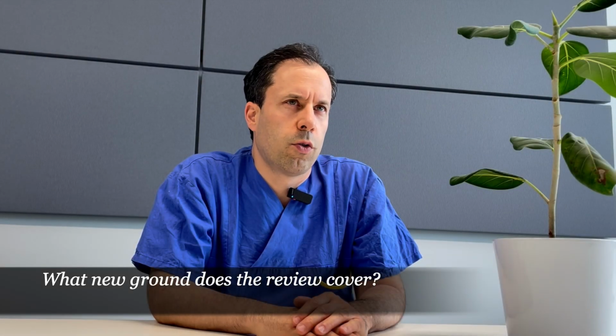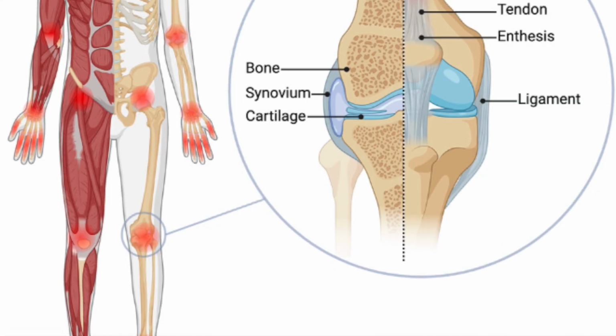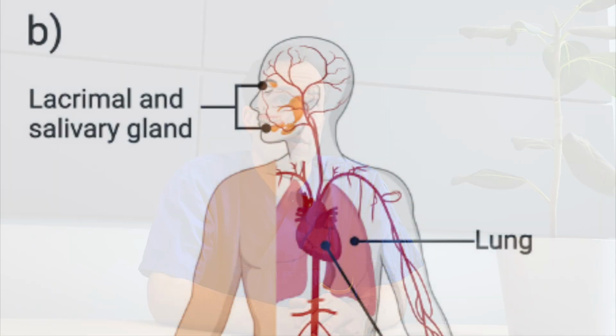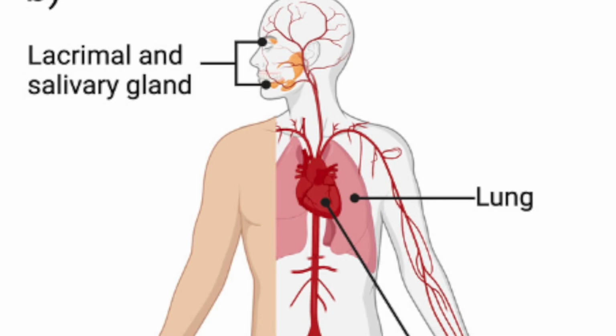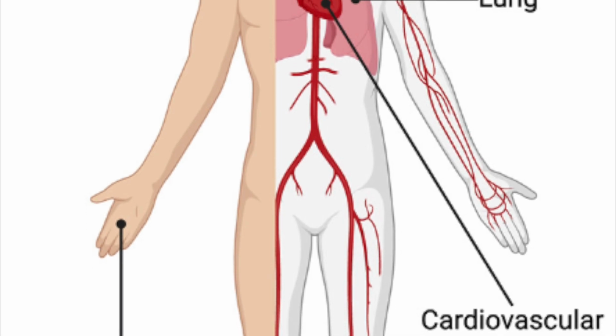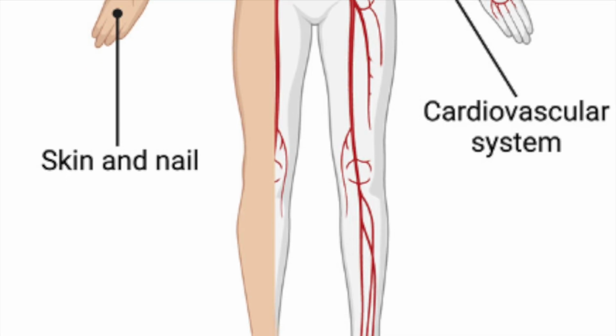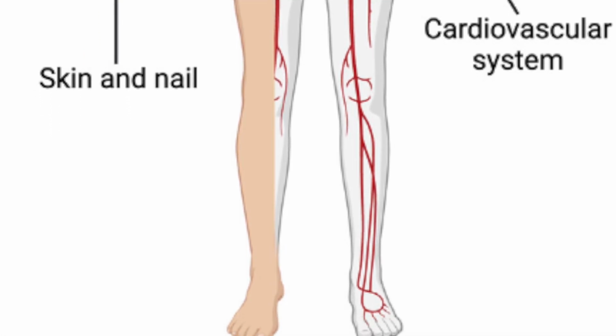We explore not only, strictly speaking, musculoskeletal targets like joints, tendons, ligaments, or entheses, which have been the focus, particularly for the inflammatory involvement, but also structural damage in the last years, but also the emerging use of ultrasound for looking at vessels, vascular imaging, vasculitis, looking at salivary and even lacrimal glands, which are really tiny, but of course extremely relevant in Sjogren's disease, lungs in interstitial lung disease over a host of rheumatic conditions, and then skin and nail, which are highly relevant for skin manifestations, psoriatic arthritis, lupus, and systemic sclerosis.